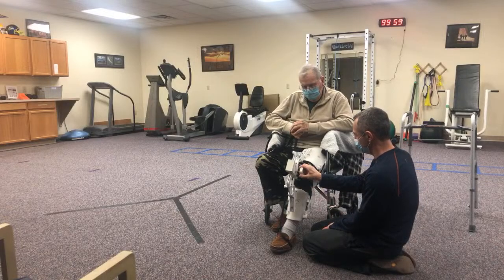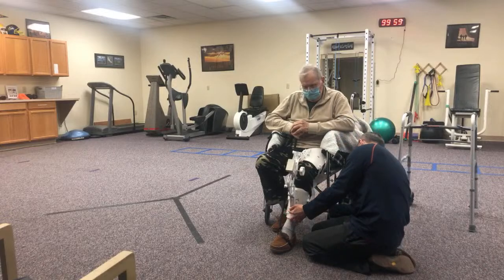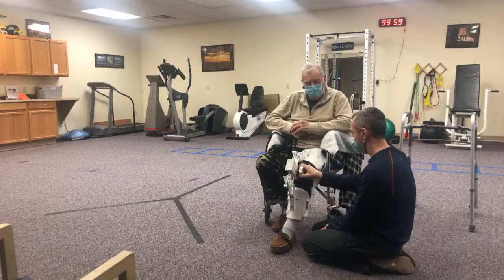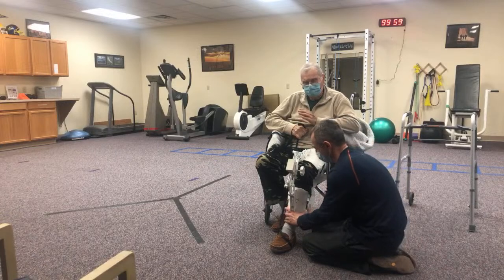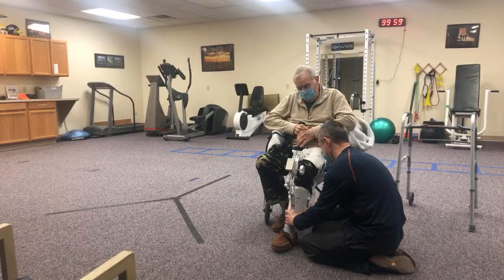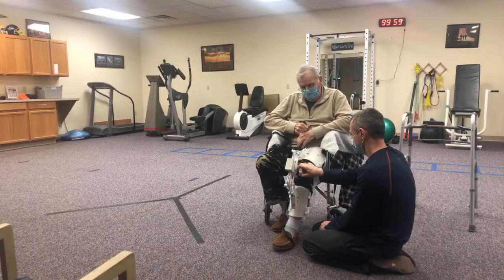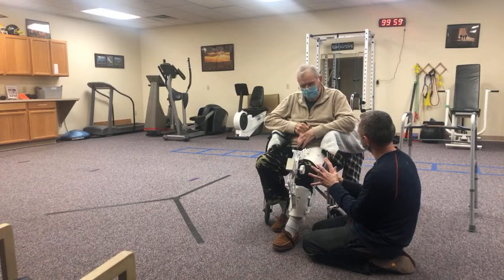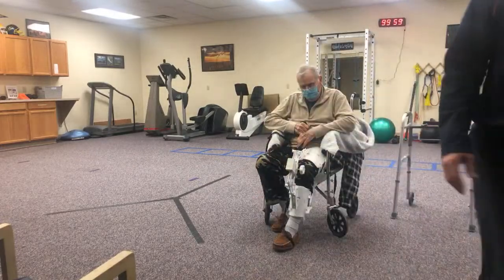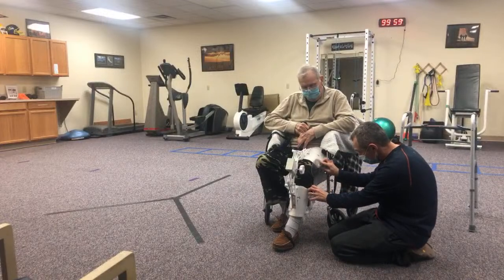I'm going to turn this up just a little bit. What does that feel like? Maybe some movement across the skin - yeah, it's trying to find the right spot. I'm going to give it a little more. Once I hear the velcro start to pull a little bit, I know we're getting snug. I'm going to take another measurement. So we were at 55 before - we're at 75 now.